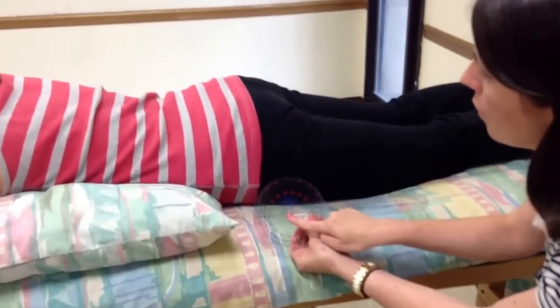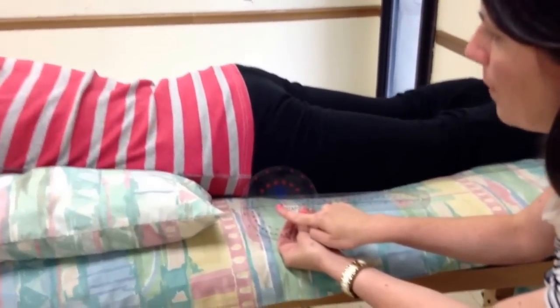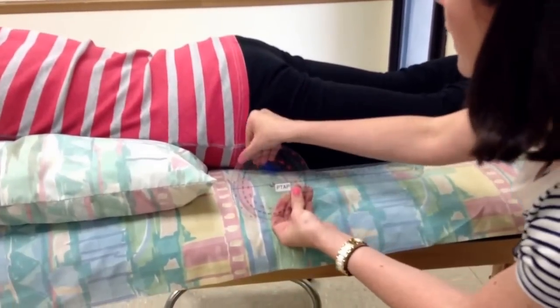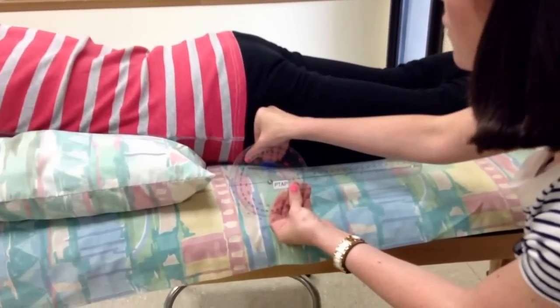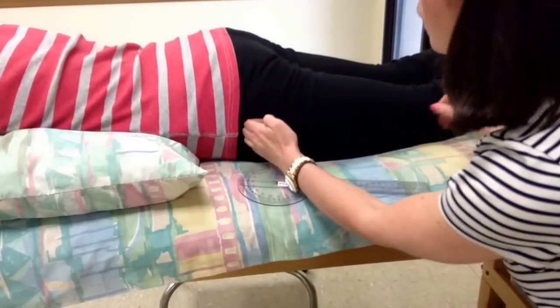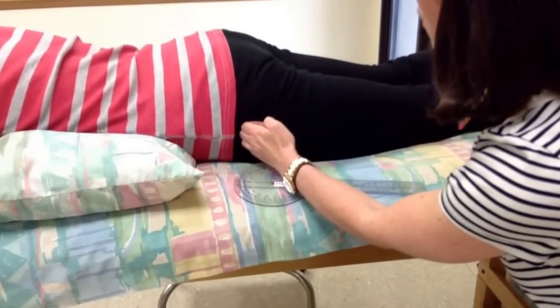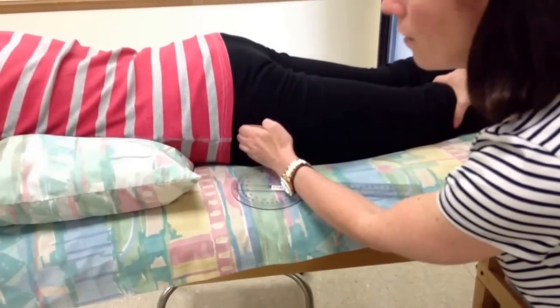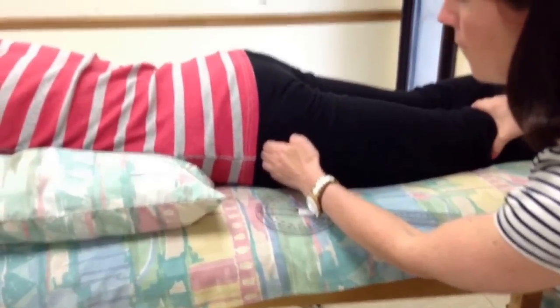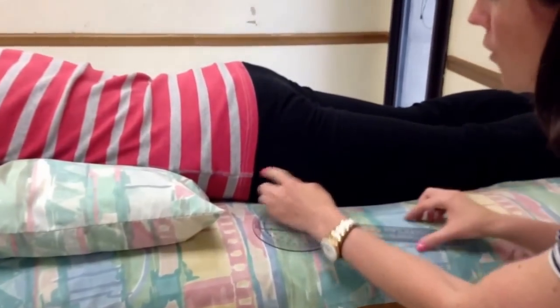The fulcrum is going to line up with the patient's greater trochanter, so you're going to have to palpate the patient's greater trochanter. If you need to, have the patient roll their leg in and out a little bit into internal and external rotation so you can find their greater trochanter.